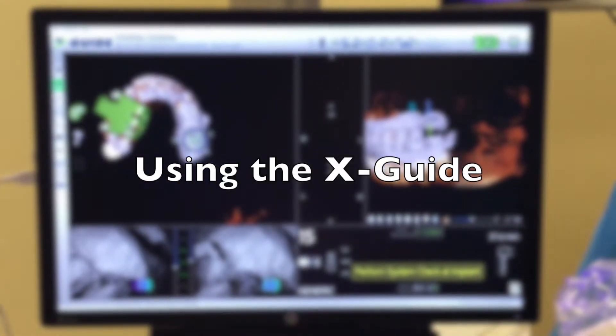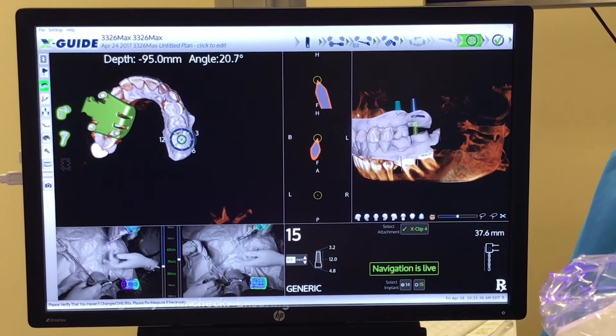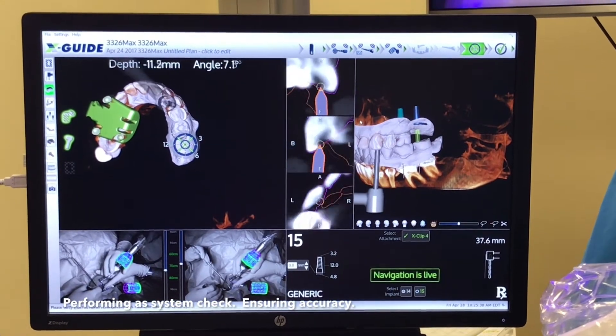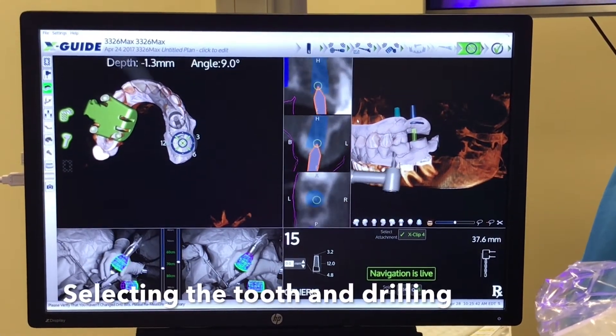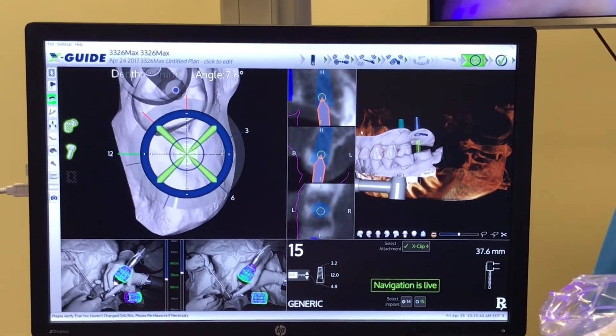This is Dr. Robert Emery demonstrating the use of the X-Guide. After we measure drill length, we touch an adjacent tooth to ensure accuracy of guidance. We select the tooth using the mouse.